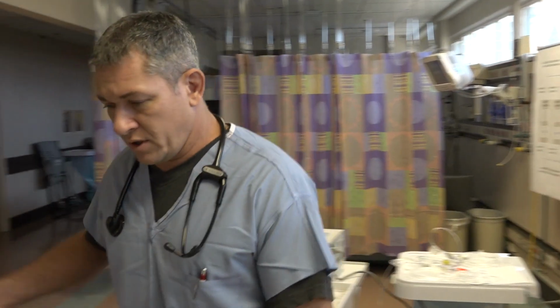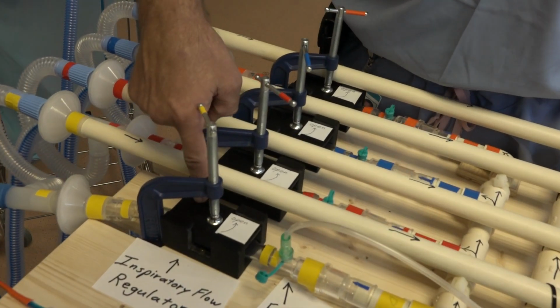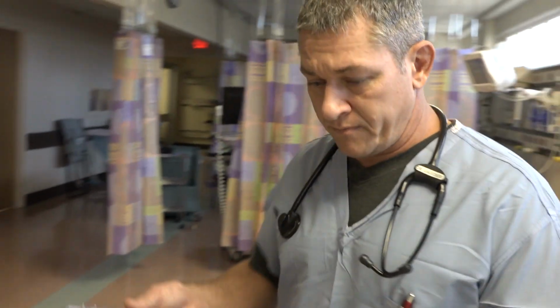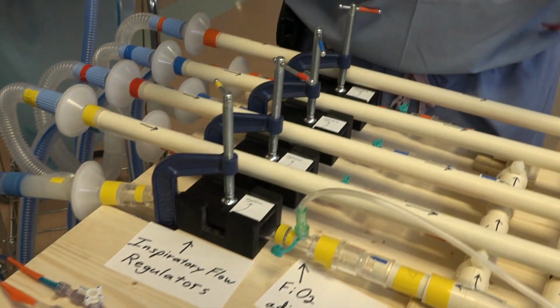So first, we'll take a look here at our new type of inspiratory valve. Before, we had the gated valve, and the problem with the gated valve was it comes with oils from the manufacturer that might be challenging to actually eliminate from the gated valve. So what we did is we used a standard number 5 LMA, and we just cut it off. And then we made attachments here.